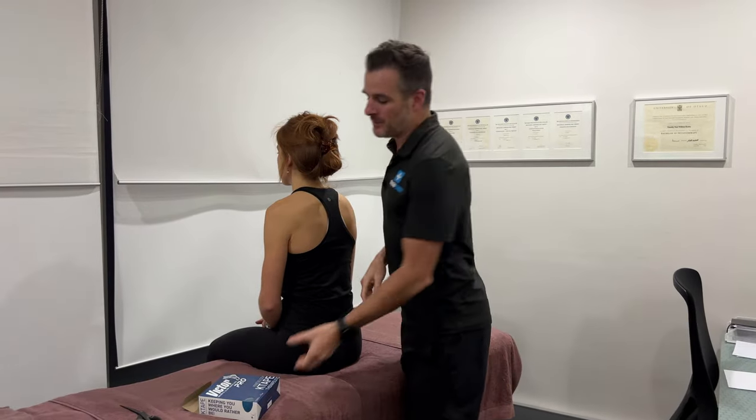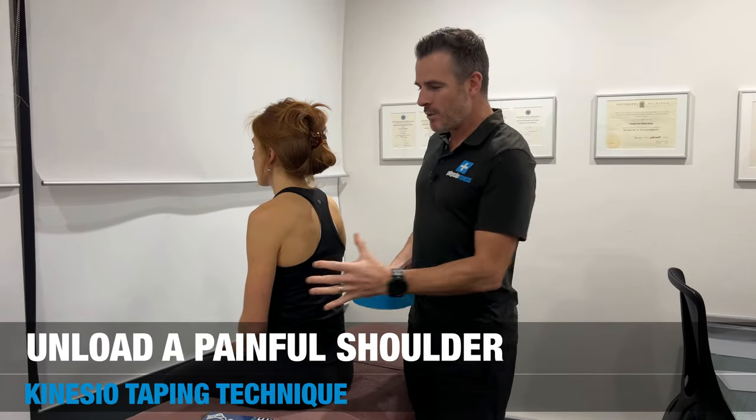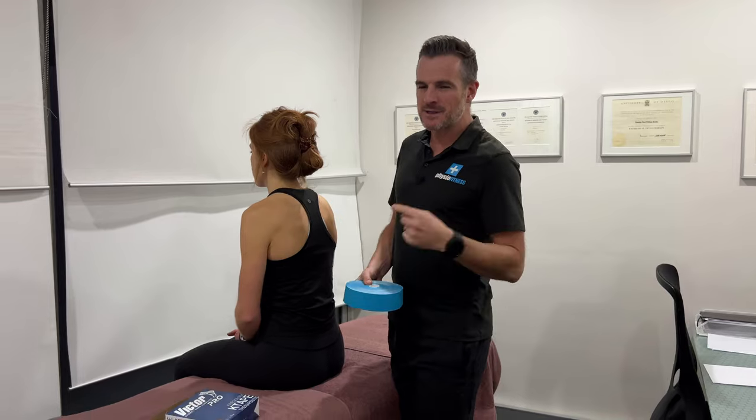Today's taping session is showing you what I do to unload a shoulder. I'm going to use kinesio tape because it's elastic, and the elastic properties of this will help lift the shoulder up much better than rigid tape.